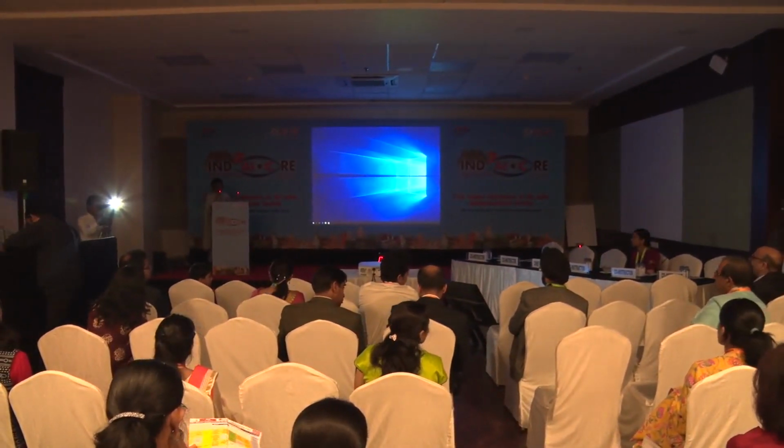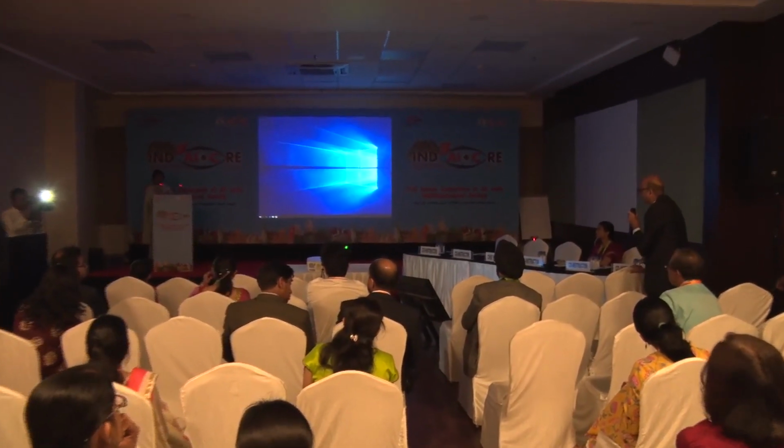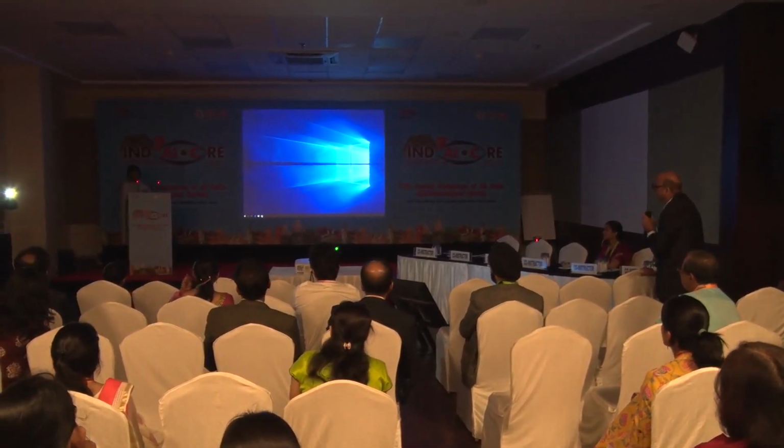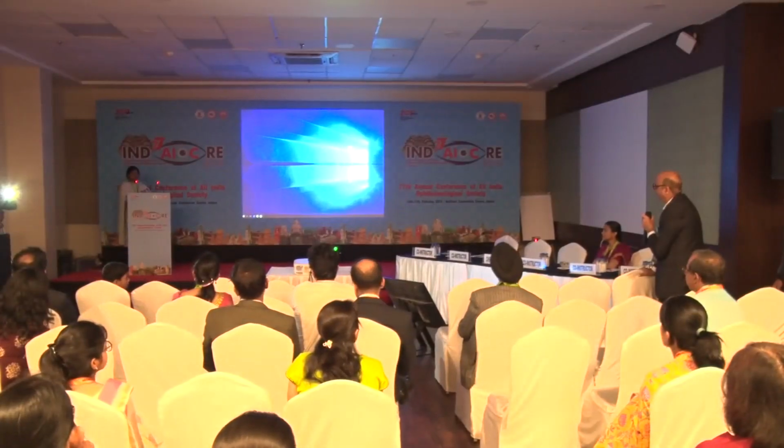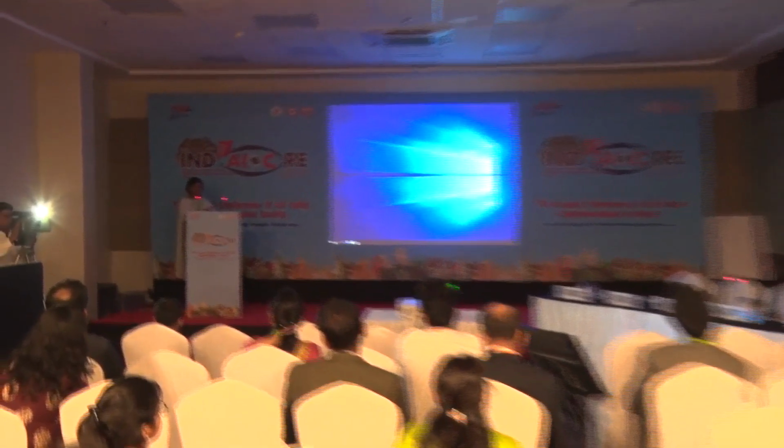I'm sorry, sir, I'm not able to hear. Regarding the scleral fixated lenses, what is your lowest cutoff limit? SFIOLs, I would say around 8 years of age will be the lower limit, because below that the scleral rigidity is not that good, so there is a lot of chance of getting postoperative hypotony. So I would prefer an age of 8 years for scleral fixated lenses. Yeah, I do.